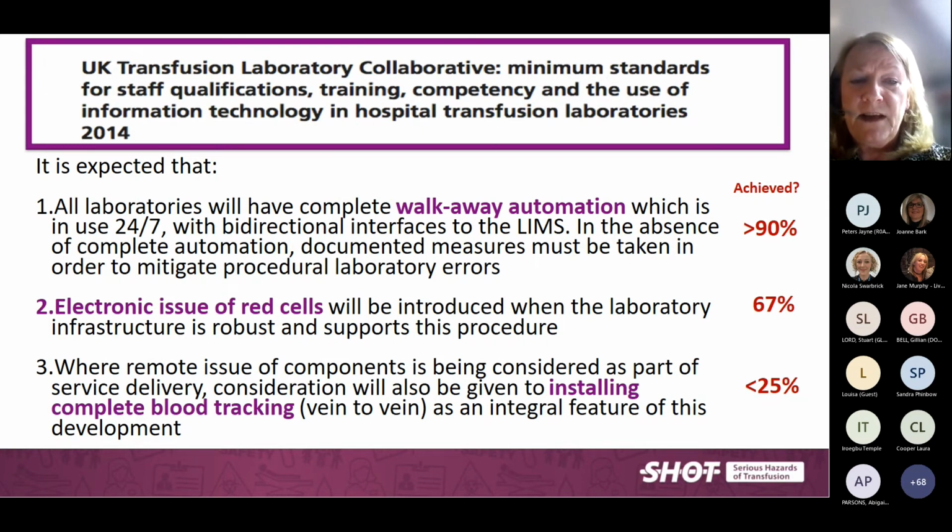That we should have electronic issue of red cells, and that is probably present now in about 2/3 of laboratories. So it's definitely not universal, and to a certain extent that is because the computer systems are not always compliant with what the guidelines and the MHRA would want us to do. But the area which was recommended way back was to consider installing complete blood tracking, particularly when you have other systems in place. And I would say probably less than a quarter of hospitals across the UK are doing this.